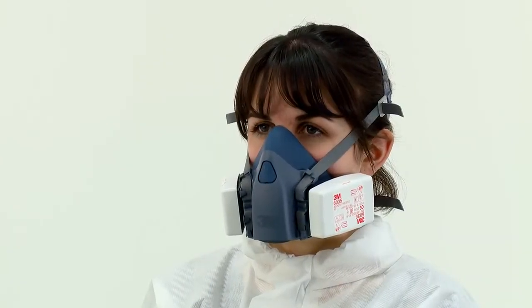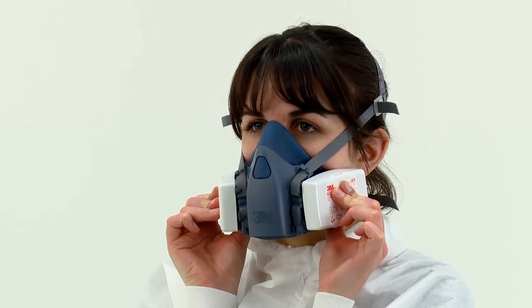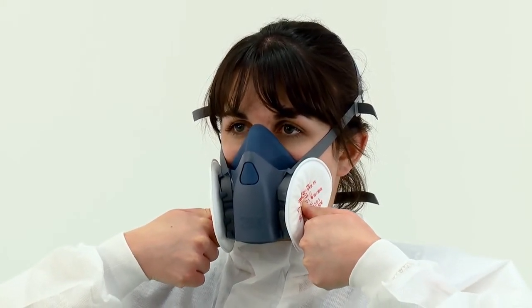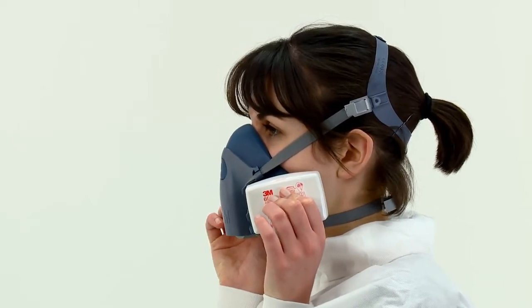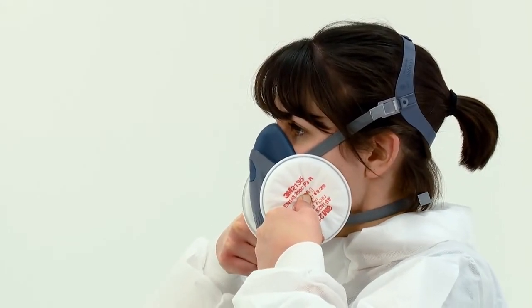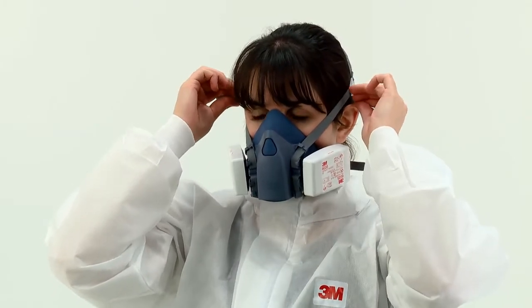The seal of the respirator on the face should be fit checked before entering the workplace. If 6035, 6038 or 2000 series particulate filters have been fitted, a negative pressure fit check should be performed. For 6035 or 6038 particulate filters, press the filter cover and filter body together between your thumb and fingers, taking special care to squeeze the filter in the middle. For 2000 series particulate filters, press your thumbs into the central indentation of the filters. In both instances, this seals the filter and restricts airflow. Whilst continuing to seal the filters, inhale gently and hold your breath for 5-10 seconds. You should feel the face piece collapse slightly. If it does not and you detect air leaks at the seal, adjust the fit, taking extra care with the tension adjustment of the straps, then repeat the fit check.